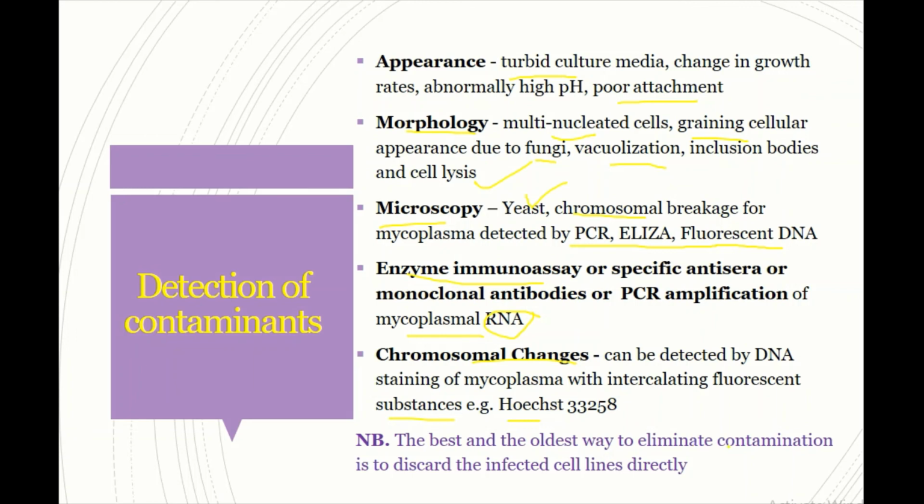The best and the oldest way to eliminate contamination, of course, is to discard the infected cell lines directly.